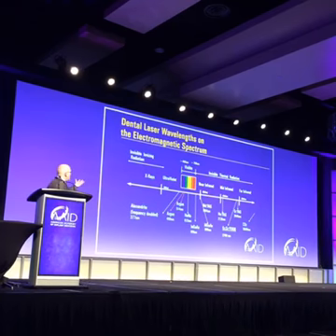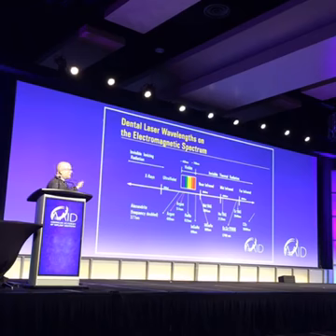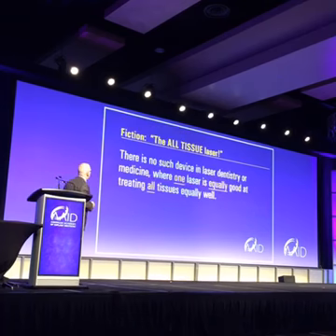You can see here what we see, the visible light, and on the left side would be the ionizing radiation, or ultraviolets, or X-rays, and on the right side, you have your invisible, which is the near infrared, mid infrared, and far infrared. This is where most of the lasers fall into, in that category.